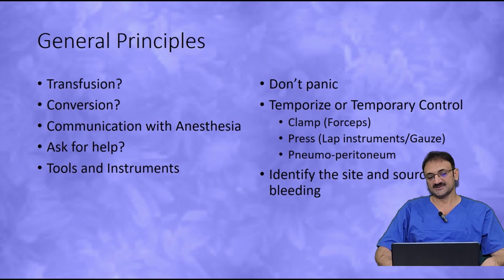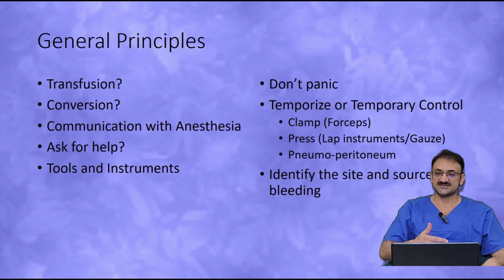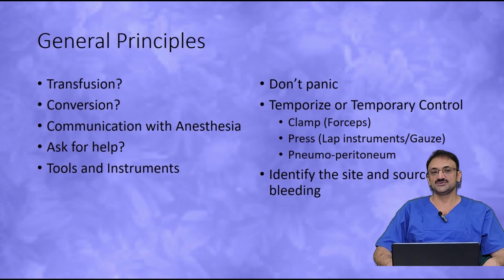And another principle, which is a general principle during any kind of complications in a surgery, is that you should not panic, because if you are panicking, the anesthetist is going to get panicked, your team is going to get panicked, the one you are calling for help is going to get panicked, and the panic situation can lead to worsening of the scenario rather than controlling it.